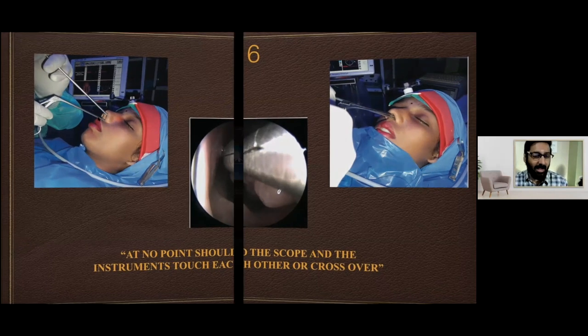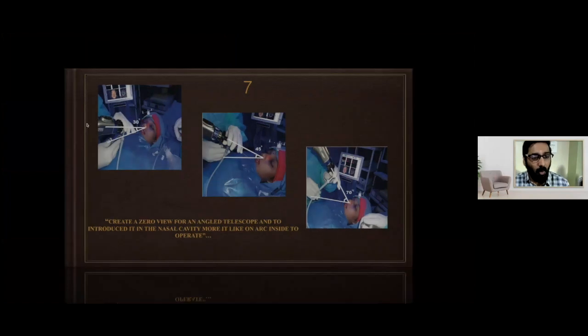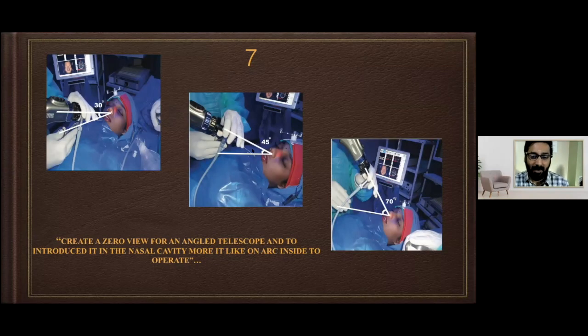When you use angled telescopes in skull-base surgery, I try to avoid them. But when you want to look at the suprasellar cistern or cavernous sinus or things like that, I might use a 30-degree, but they are only for visualization, not for operating. Why? Because we don't have instruments. If it starts bleeding there, we don't have instruments to go laterally or superiorly to control the bleeding. So these are basic things I want to tell you.